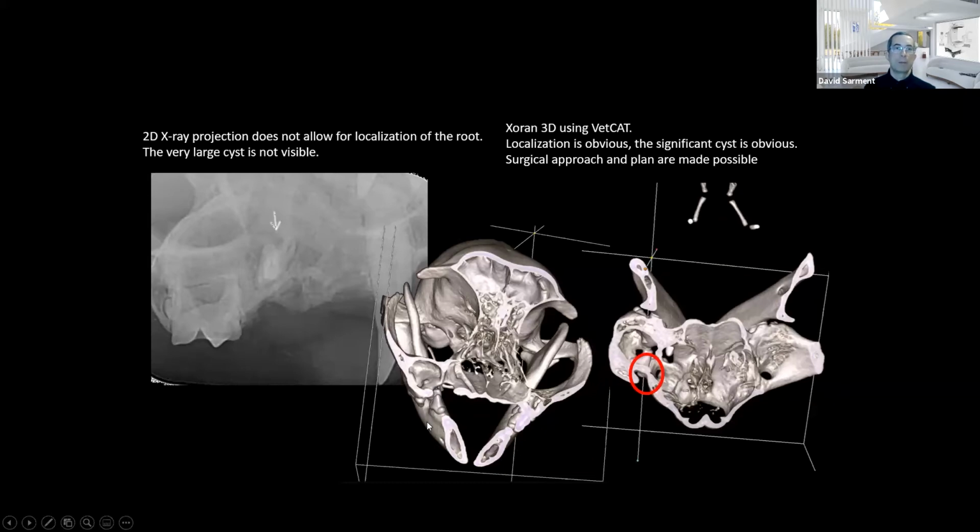And what I found on the human side, when we started to do cone beam CT in particular, because it became so easy to use for us as well, is that we were so predictable in our surgeries that all that was left in surgery was how quickly can I do the surgery? We already knew exactly what surgical approach we're going to do. We knew exactly what we're going to find. And what is left at that point is how well am I organized to get into surgery, get down, suture, and get out and just go faster. And as we know, faster doesn't mean it is a fast surgery. It just means it's an efficient surgery. And because it's efficient and more precise, patients heal that much faster and that much better. And your approach can be more conservative.